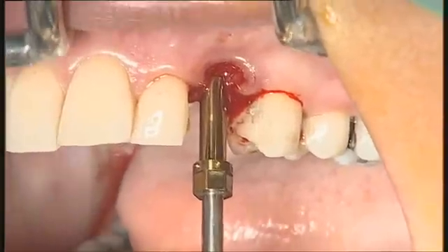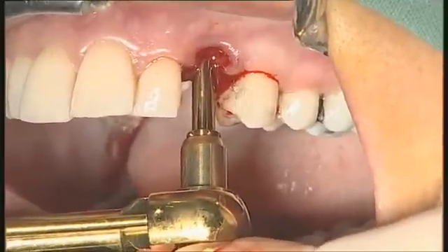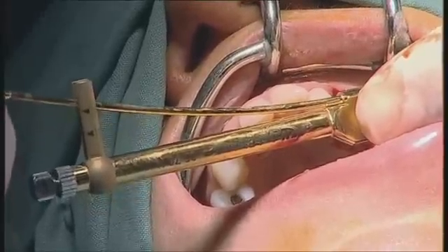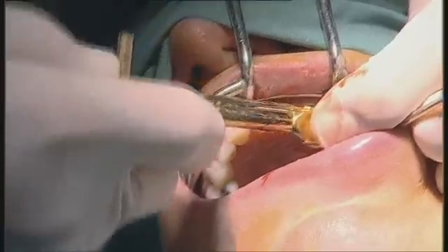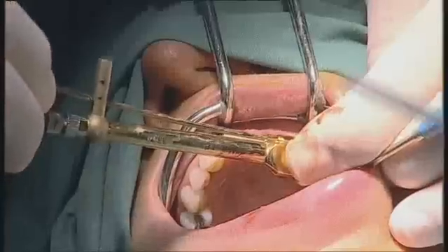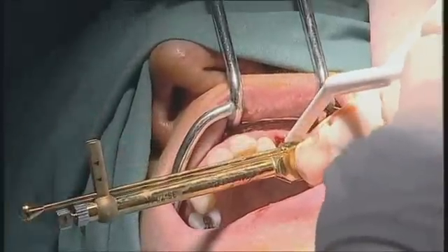Here I'm about at bone level. We'll check if the torque is not too high. I don't like having more than 40 Ncm — it's much too high. So we will decrease it slightly. I don't like exceeding about 40–45 Ncm. That's good.